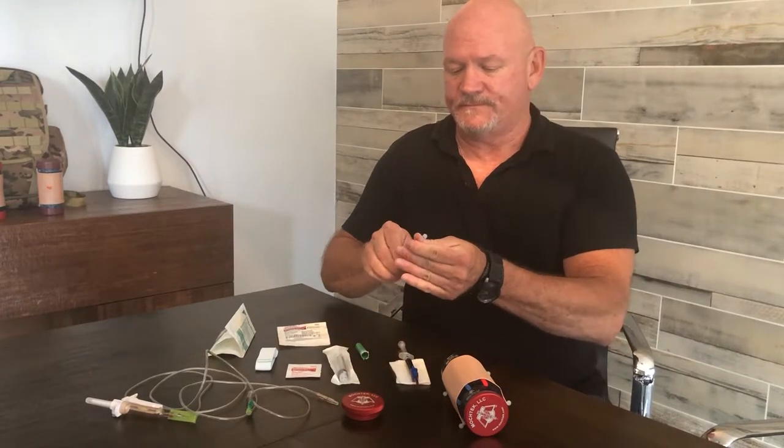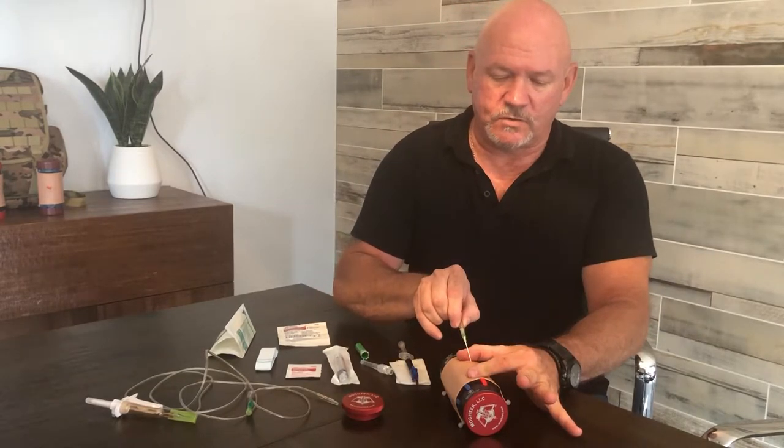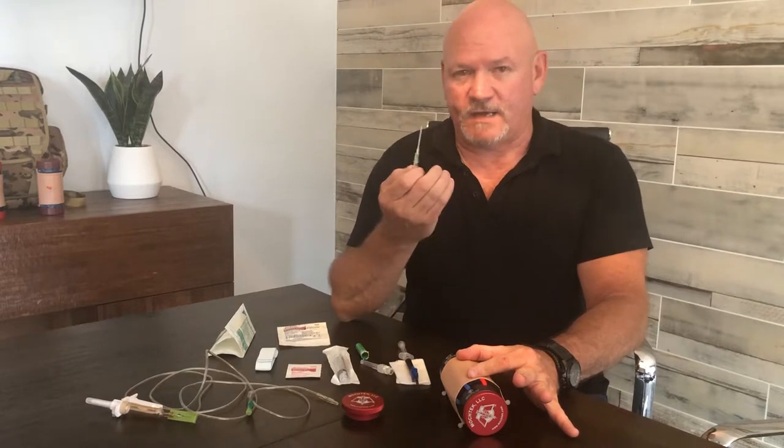You're going to take your needle, bevel up like we did before, do your C method, hold down tight, and you're going to go in. Once you puncture, you're going to actually get a flashback.